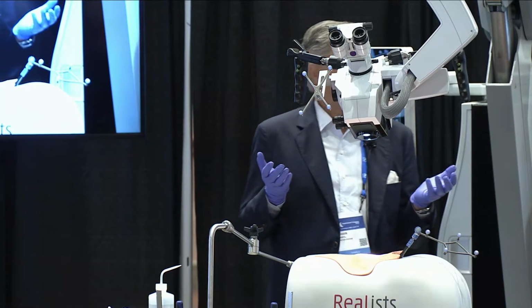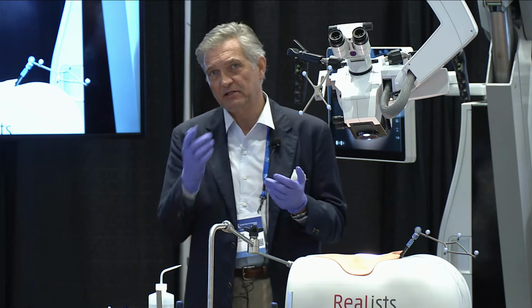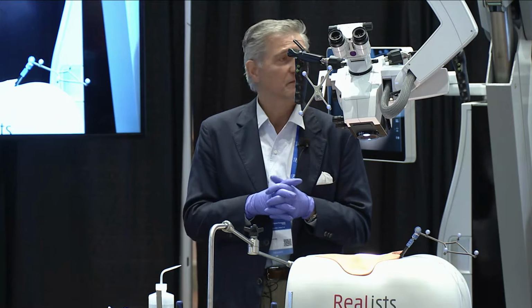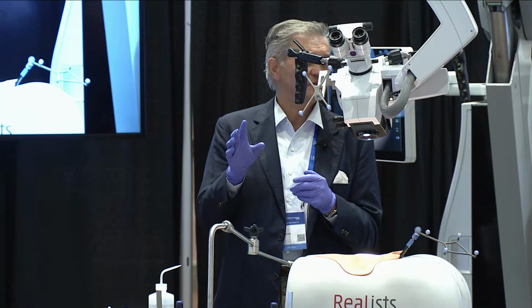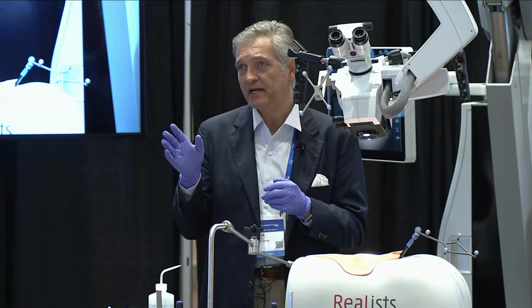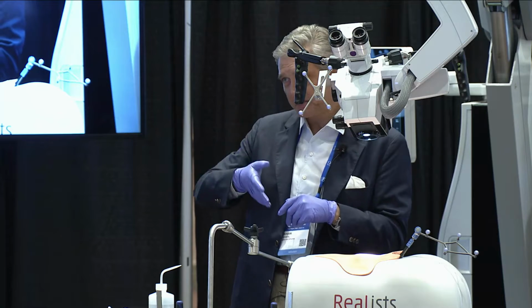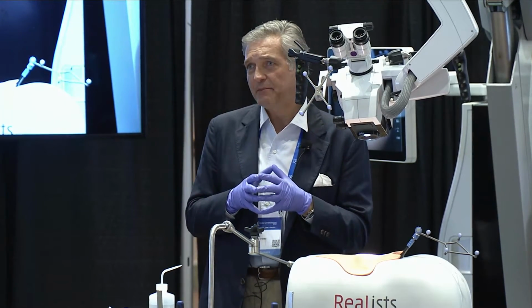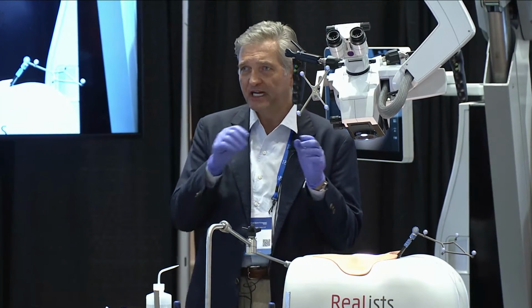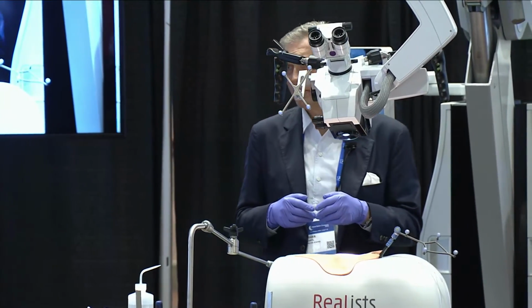Now, we set this up for augmented reality, and that's something that I presented at this meeting, and we just got that paper accepted in a journal. I don't use augmented reality for the screws, but I use it for the landmarks throughout the TLIF procedure. There are certain landmarks that you use for the operation: bony landmarks, the pedicles, and then the disc space in between, the facet joint, the lamina. Those are the landmarks that are always the same for every TLIF procedure, and therefore I like to inject those into the microscope, and I'll show you how that works. Hopefully it'll work here the way that it works at home, but I think it will.